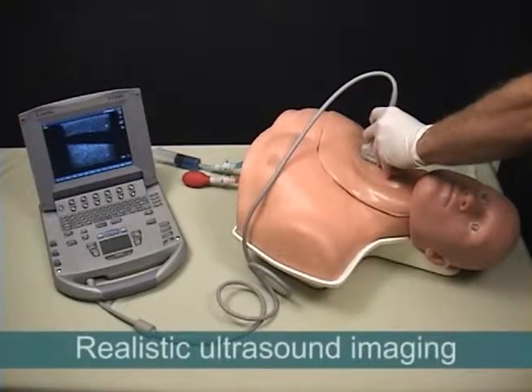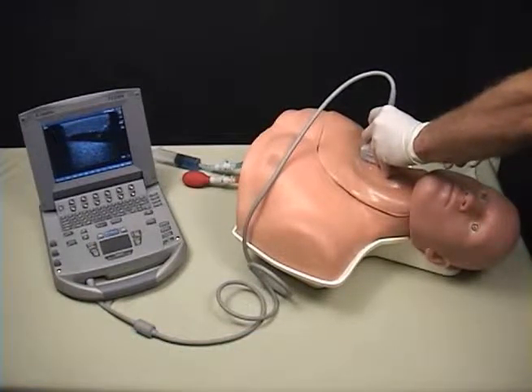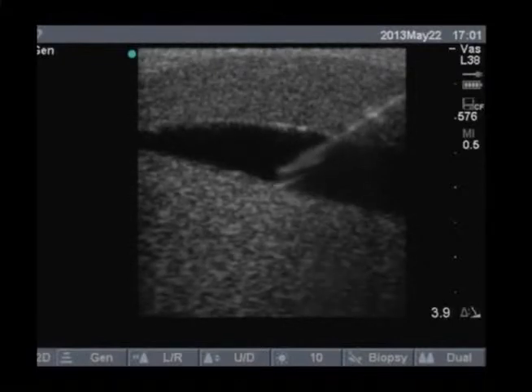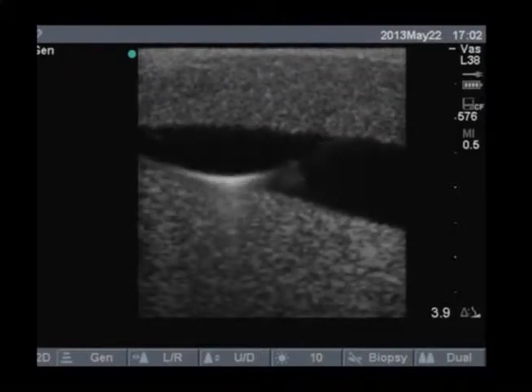Central LineMan offers exceptional ultrasound imaging properties and is compatible with all commonly used ultrasound machines. Even after repeated needle insertions and full catheterizations, there is little degradation of the ultrasound image due to previous procedures.